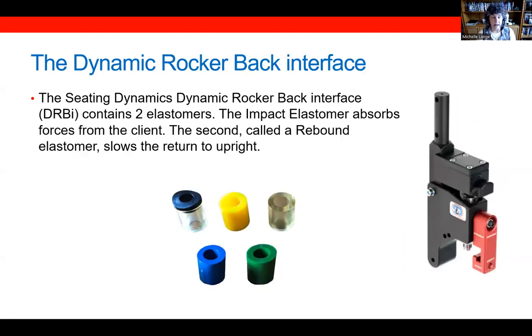So the Seating Dynamics dynamic rocker back interface contains two elastomers. There's an impact elastomer and a rebound elastomer. The impact elastomer is what actually absorbs the forces from the client as they extend posteriorly at the hips. The second, the rebound elastomer, helps to slow the return to upright so that we have a very smooth movement for the client.